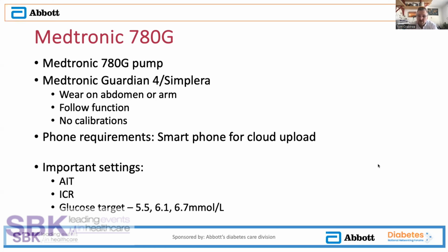And one of the big things with the Medtronic is it doesn't necessarily require the use of a smartphone. So if you've got someone who can't afford the most up-to-date smartphone, or doesn't have one that would be compatible with other systems, they only really would need to use a smartphone for cloud upload. Otherwise, they can interact with their diabetes through the pump.